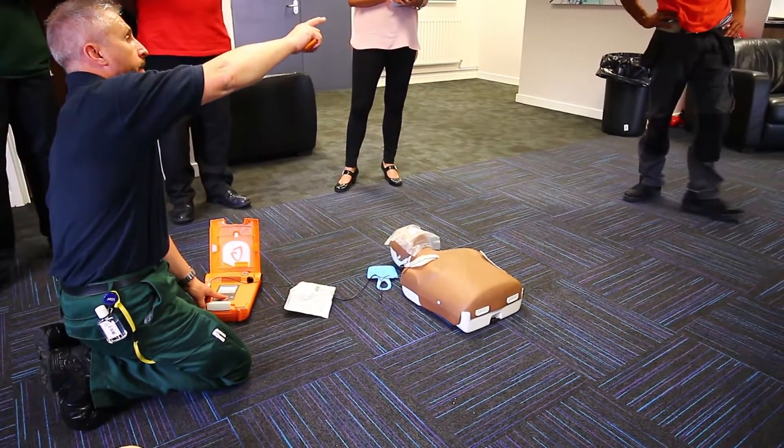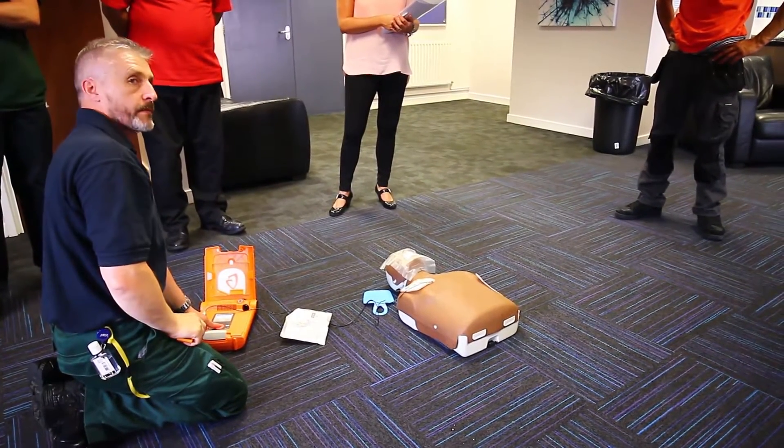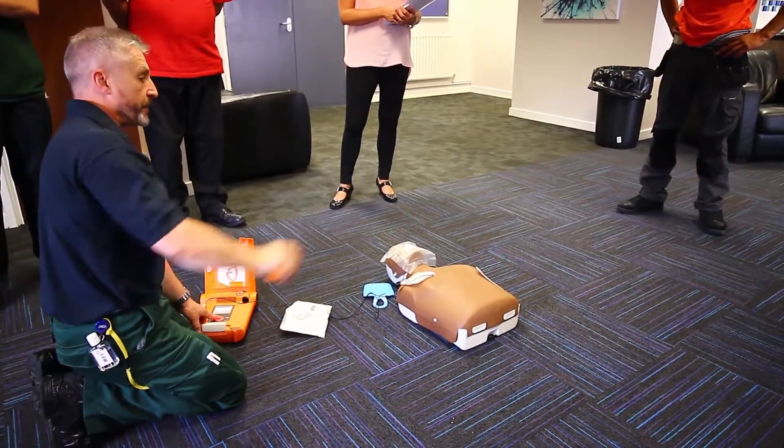Shock advised. Clear behind me. Clear. Clear behind you. Patient clear. Press red flashing button to deliver shock. Shocking patient, stand clear.